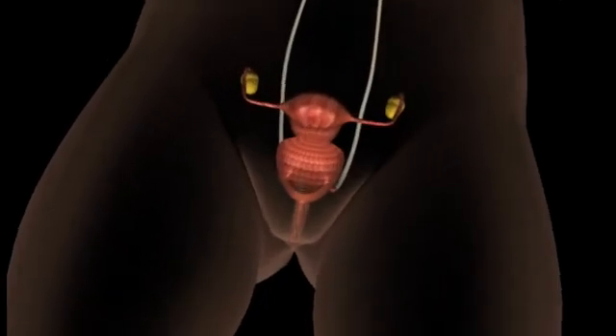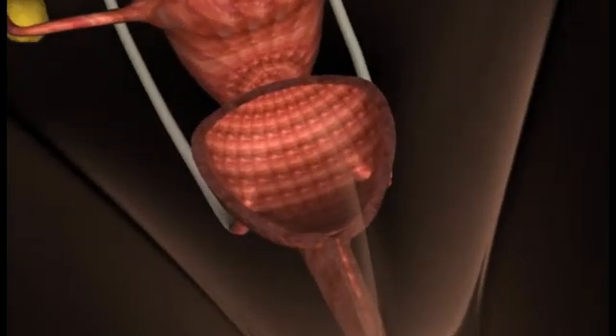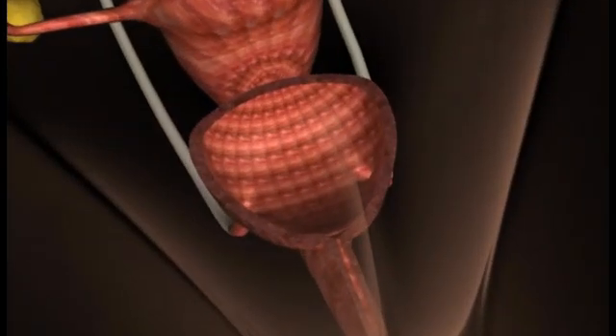The simple procedure consists of a number of small injections into the wall of the urethra, close to the bladder neck. A cystoscope is introduced into the urethra.